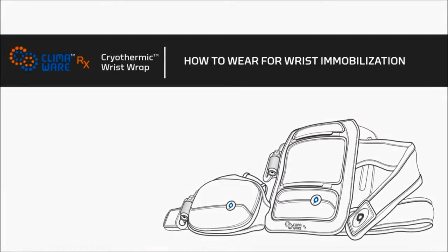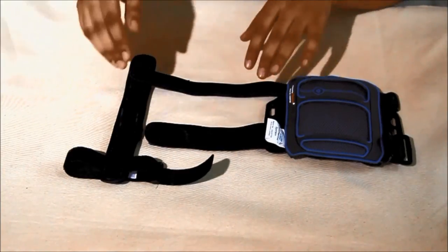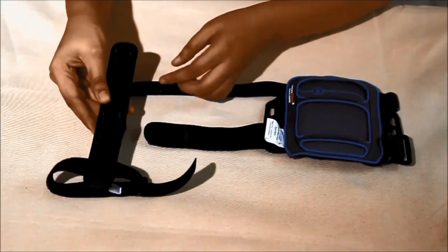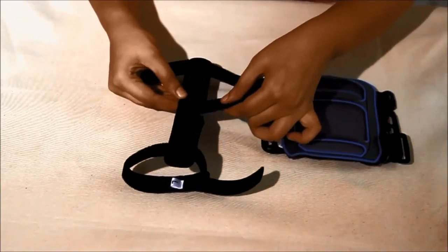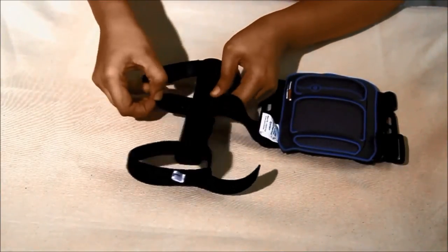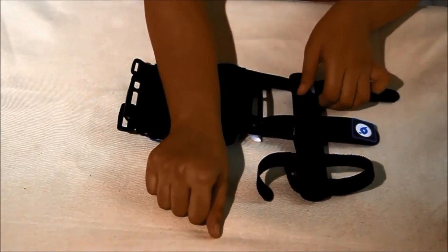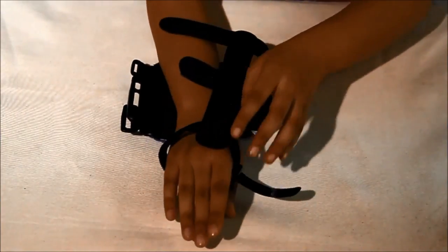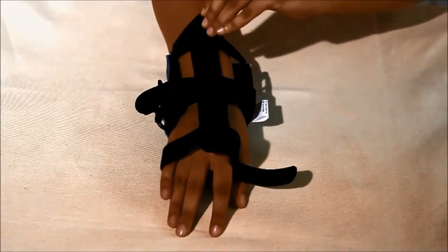How to wear for wrist immobilization: an attachable immobilizer is provided that allows splinting of the wrist when additional stability is needed. For immobilization, orient the main body on a flat surface and insert the straps of the main body into the slots provided on the wrist immobilizer. Place the immobilizer on the dorsal surface of the hand and position the wrist wrap main body at the appropriate position on the wrist. Then secure the straps in place with velcro.